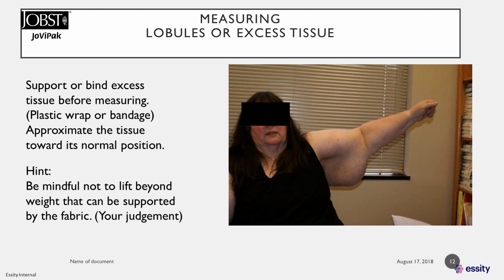Be mindful for the abdomen not to lift it beyond the weight that the abdomen can take, as it can interfere with normal breathing. These garments can only support a certain amount, and it would be your judgment to determine whether that amount will be supported by the garment that you're ordering.